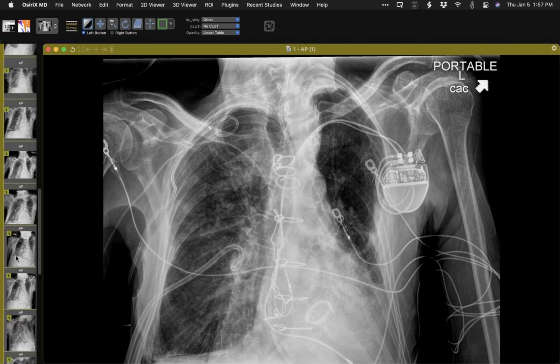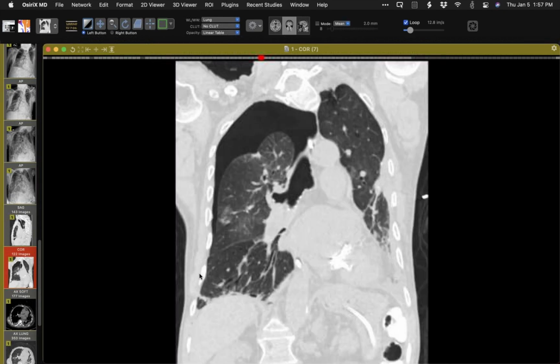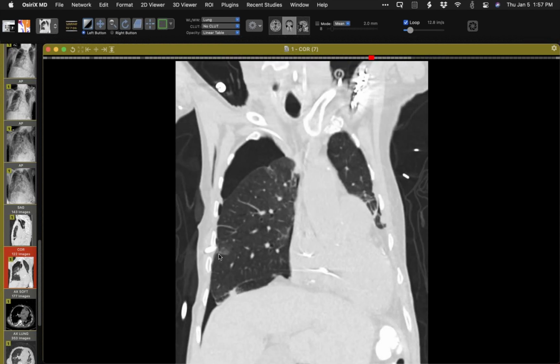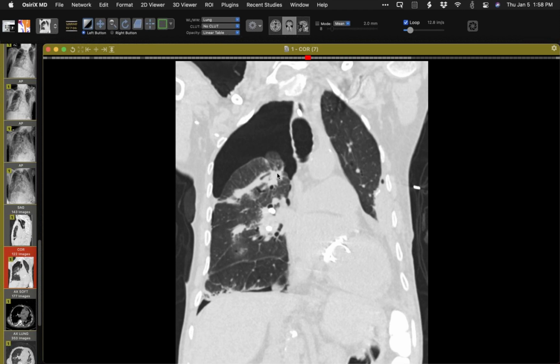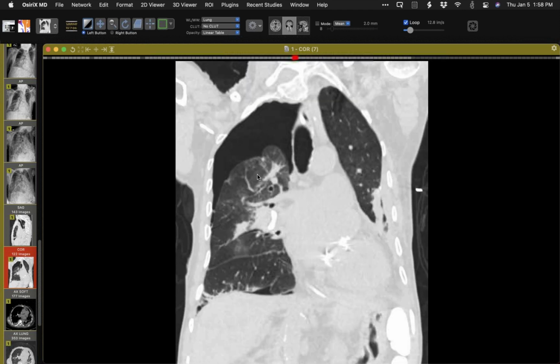This one here is the one that's in the kind of middle lobe area. I'll show you the coronal of that one. So here is the current one coming in laterally, and it goes there, ends up fairly close there, and then you can see the track of the one that he had previously going through there.